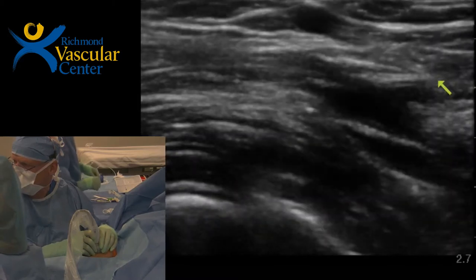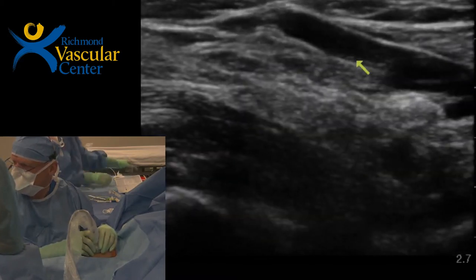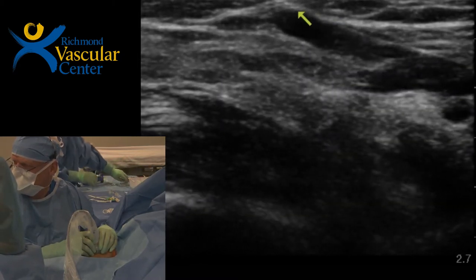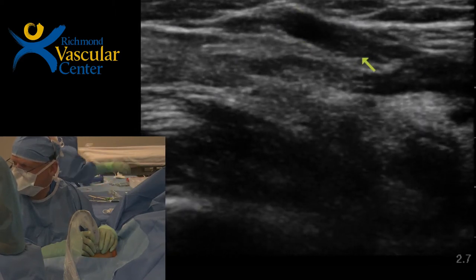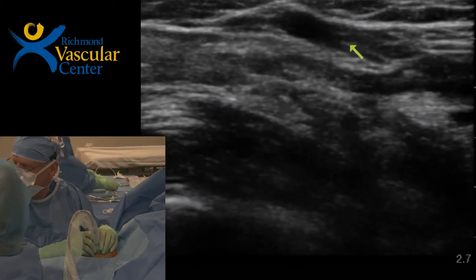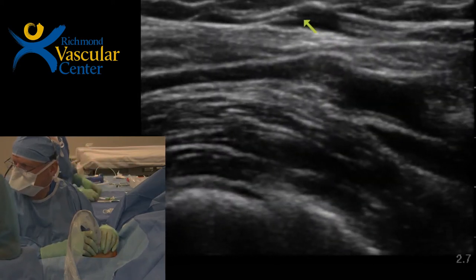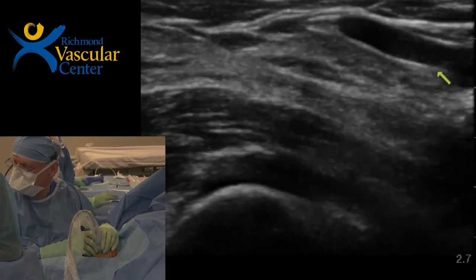Except for that, you want to be careful not to stick. Let's say you try to stick the top of the perforating vein. What you want to make sure is you don't stick halfway down the perforating vein, because it's a lot of times. So I'm going to try and pick a spot a little bit higher, and realizing that you're going to be coming from lateral to medial.